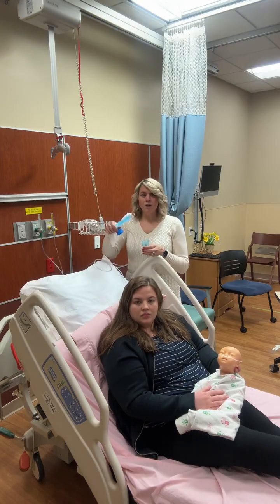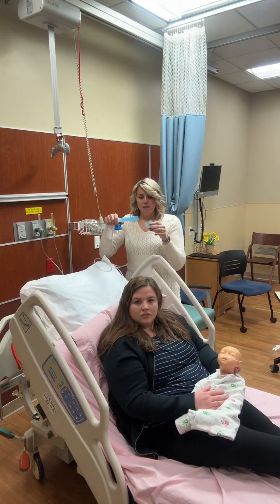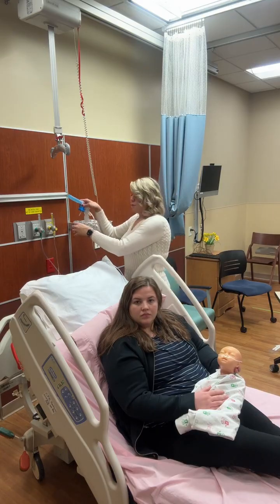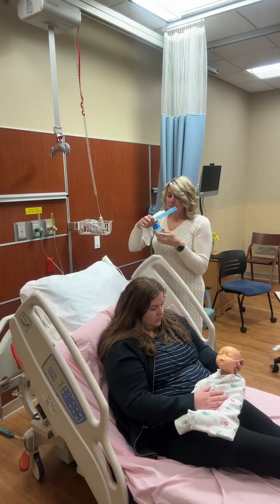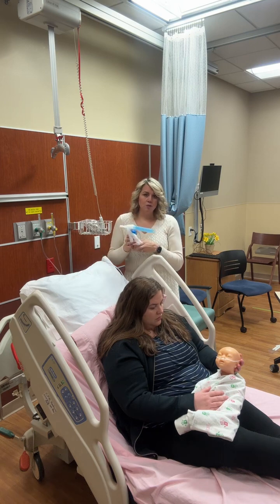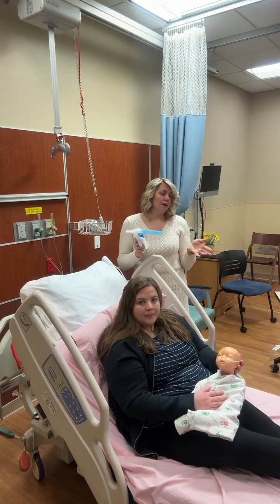Sometimes you might see RT comes and goes and gives the breathing treatments. When they get done, they empty the rest of the fluid and then they stick it in the bag apart so that it has time to dry out, so it's not just sitting in there. That is typically how we will give a blow-by to an infant or small child who cannot use a mouthpiece and who cannot wear a mask.